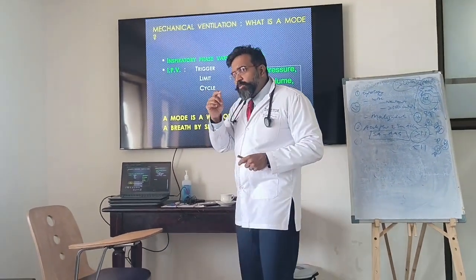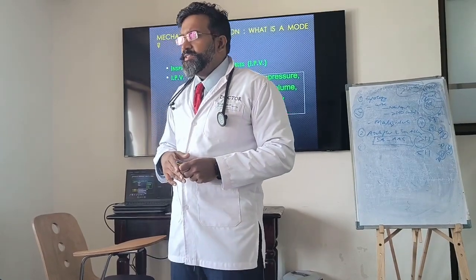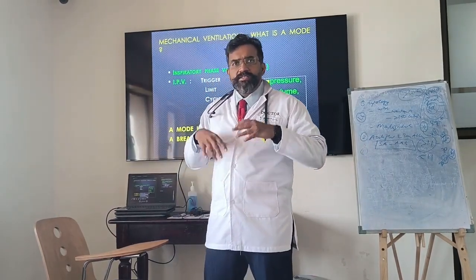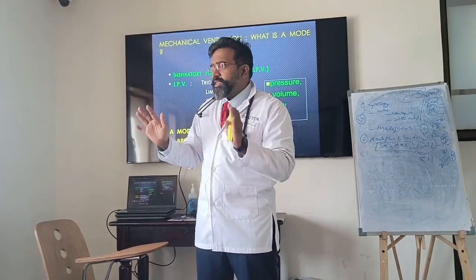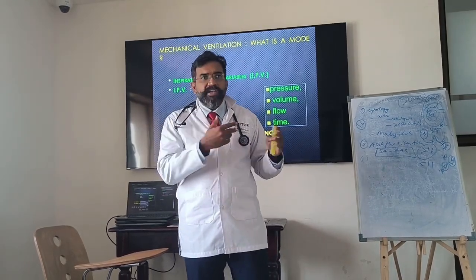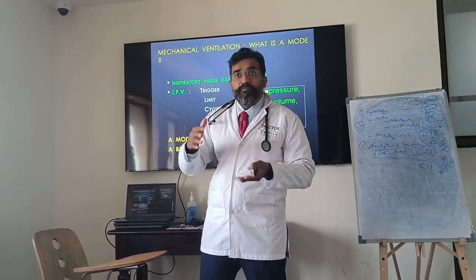Apart from this, you also talk about one more terminology, which is the variable. So you set certain things which are constant, and there are some things that come out to be variable. So it is common sense that if I want to put the patient on a ventilator, I should be monitoring the variables because I have set the rest of the breath. The rest of the breath I have set, it is going to go the same way, but what I am going to monitor? The variables.